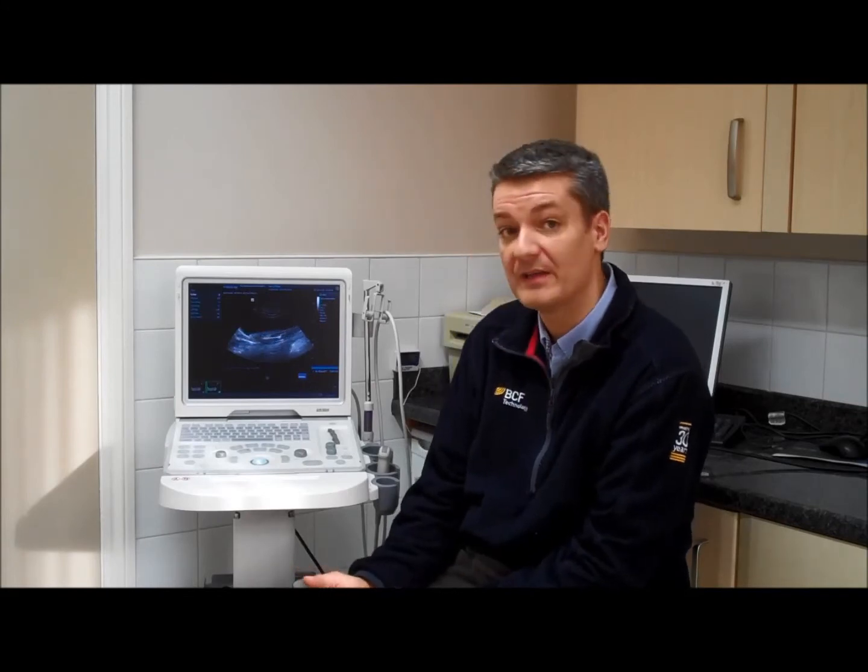So the Mindray Z5 — really easy to use, fantastic image quality, and great value for money. Give us a call and we'll be happy to come along to your practice and give you a demonstration and show you just how good it is. Thank you very much.